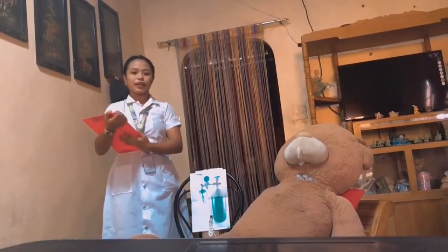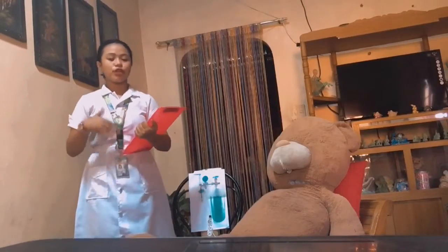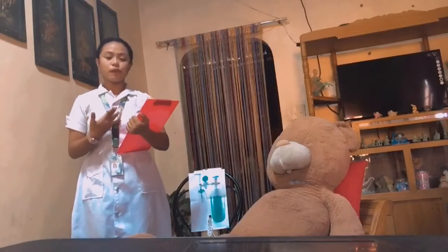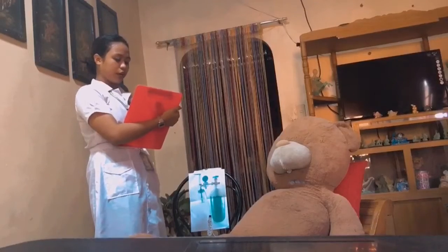Okay, now we need to proceed with the procedure. For the first step, we need to introduce ourselves to our patient and verify his or her name. So, good day sir, I'm Betty, your student nurse for today. May I ask what is your name? Okay, how old are you na po?